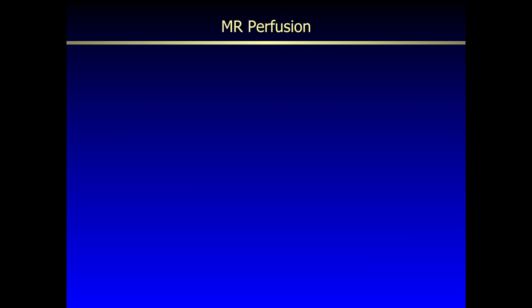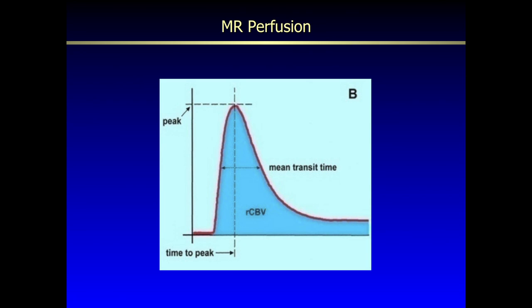Last, we have MR perfusion. With the injection of contrast, every pixel on the image will get brighter and then it'll come down as the gadolinium washes out of your body. Okay? So you had a question about how fast it washes out. It's pretty quick. This is on the order of seconds, so it goes in and out. It'll be totally out of your body typically in half an hour.